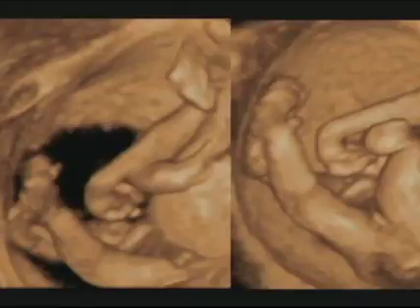Another thing that 3D surface rendering is very helpful for is to get the global picture of how the fetus is lying. 2D enables you only to get one thin slice at a time. And so you depend on getting a lot of little thin slices and conjuring up in your mind what the fetus looks like in 3 dimensions. But here you can actually display what the fetus looks like in 3 dimensions and get an entire view of the whole uterus all at once.